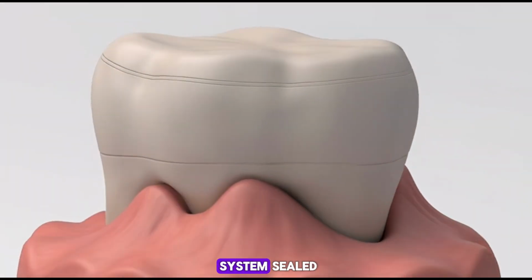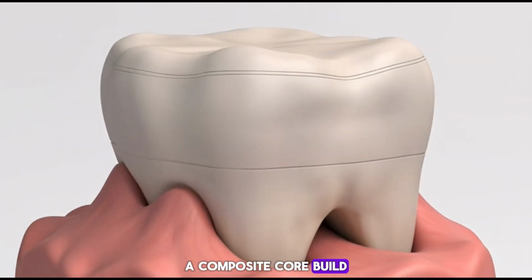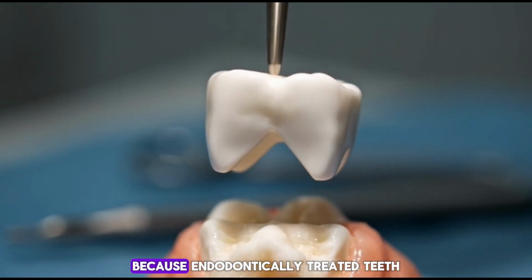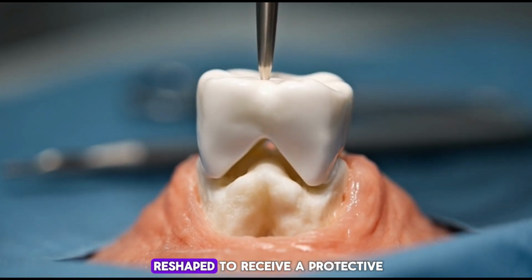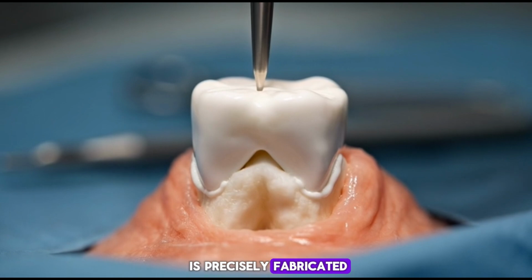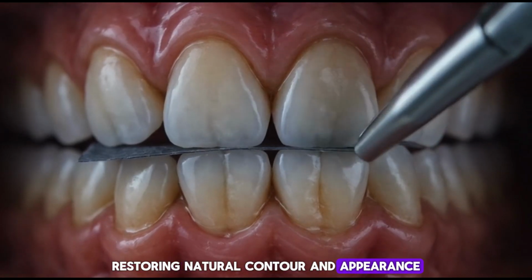With the root canal system sealed, attention turns to restoring strength. A composite core build-up replaces lost internal structure, reinforcing the tooth. Because endodontically treated teeth can become brittle, the outer crown is reshaped to receive a protective ceramic crown. The crown is precisely fabricated and then permanently cemented, restoring natural contour and appearance.